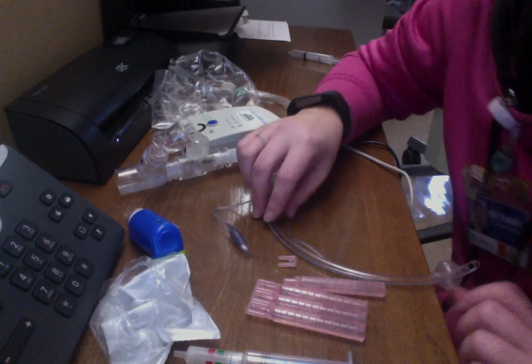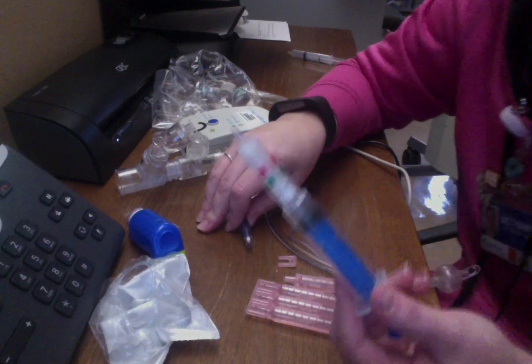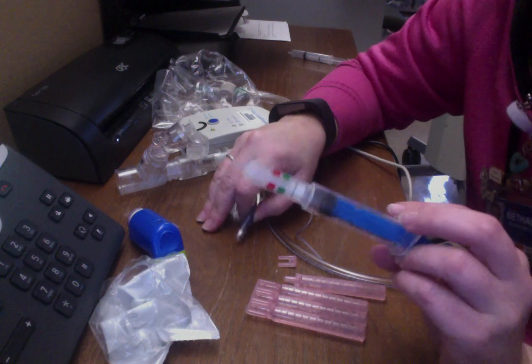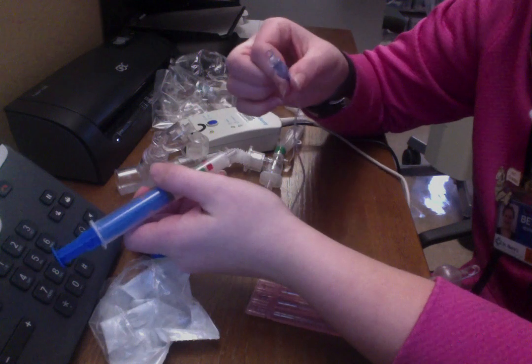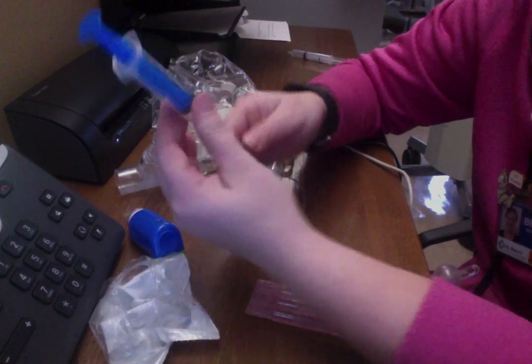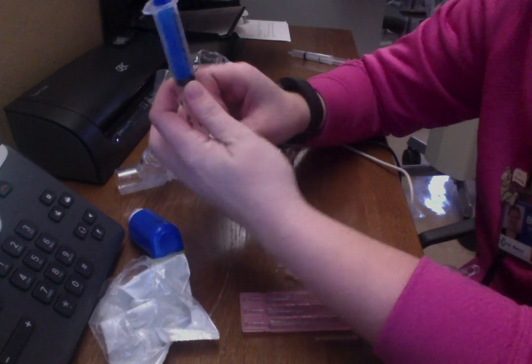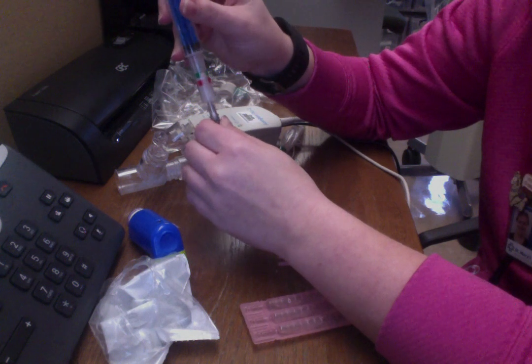The first thing I'm going to do is check my patient's cuff pressure. We have these little disposable cuff manometers because we've broken all our other ones. I go to my little pilot balloon, which is nicely inflated, which tells me that my cuff is inflated. You just push this on to here.